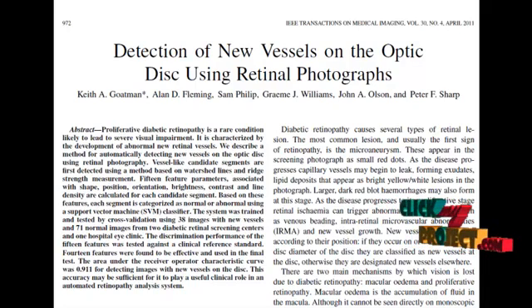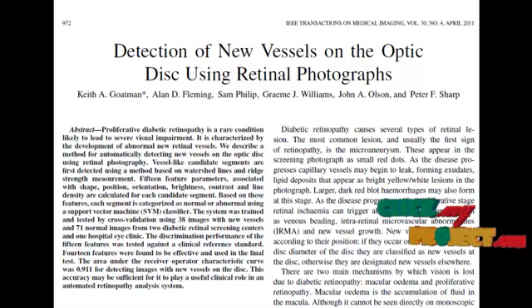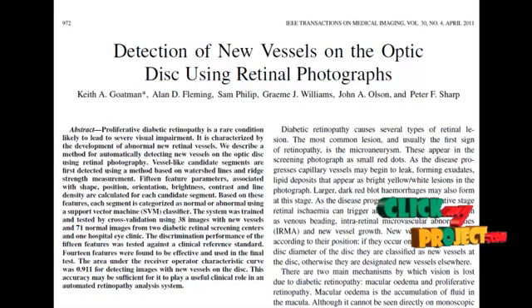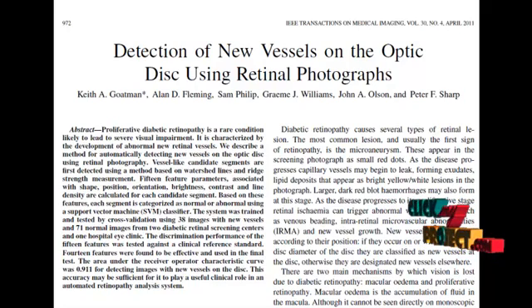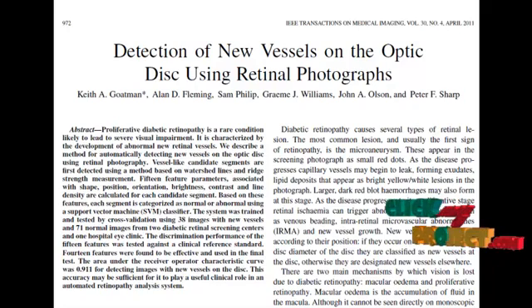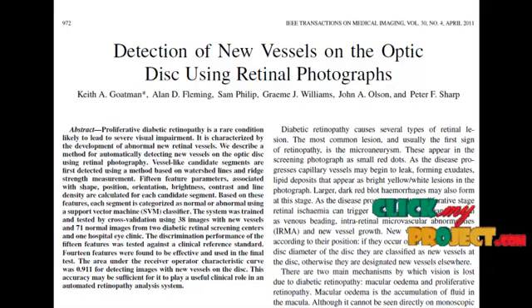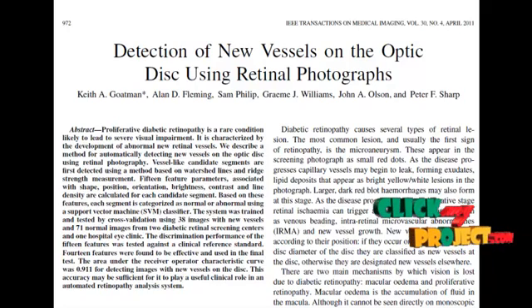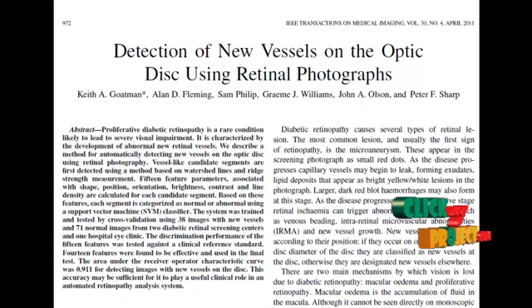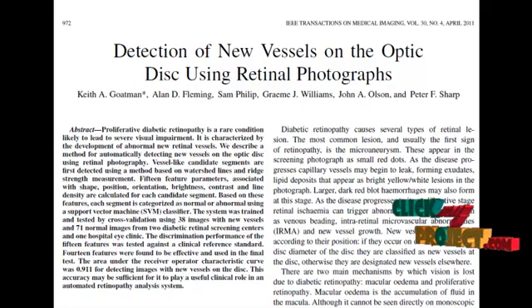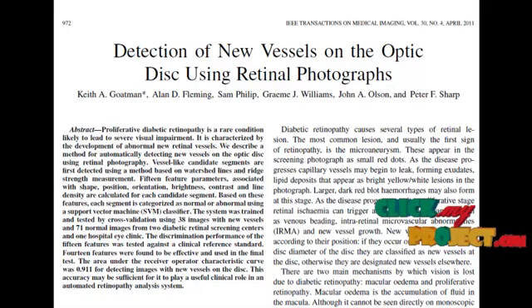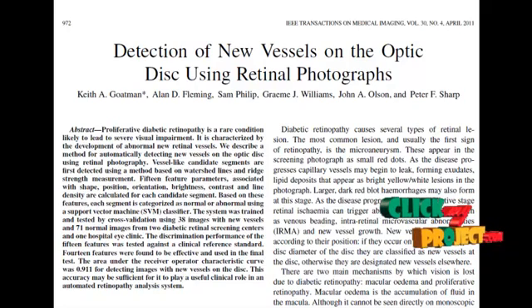One is macular oedema, another is proliferative retinopathy. The macular oedema is the accumulation of fluid in the macula. Although it cannot be seen directly on monoscopic photographs, its presence may be inferred by indicators such as exudates.